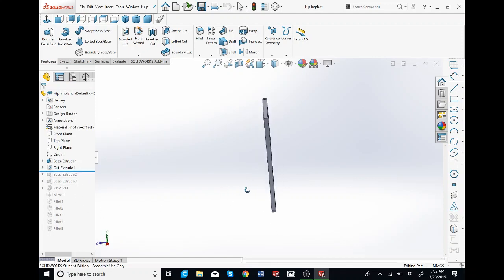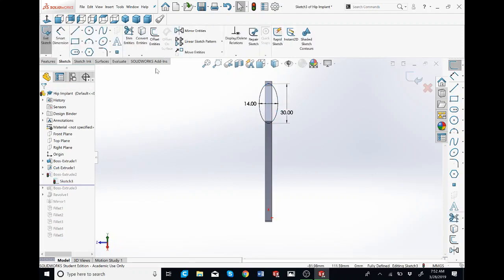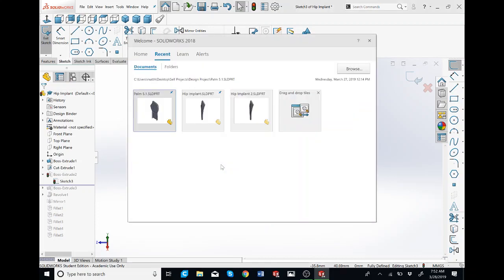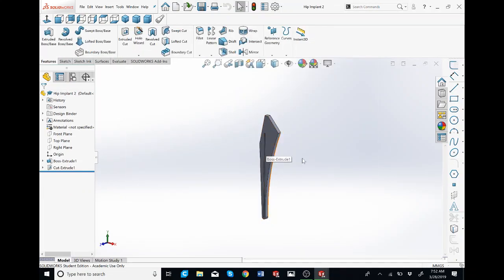You can see I have my master model over here. I'm going to scroll this down and we'll start with the next one. Right click, edit sketch, so I know what sketch it is. I don't have the model open, so I'm just going to press R for recent and then click on the hip implant 2, the one I made yesterday.